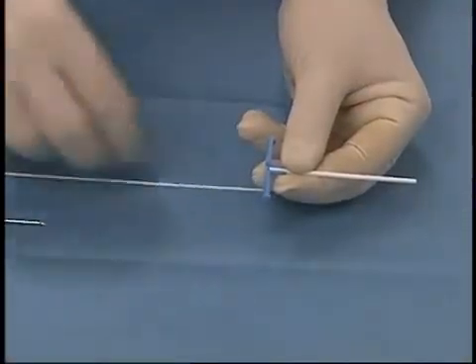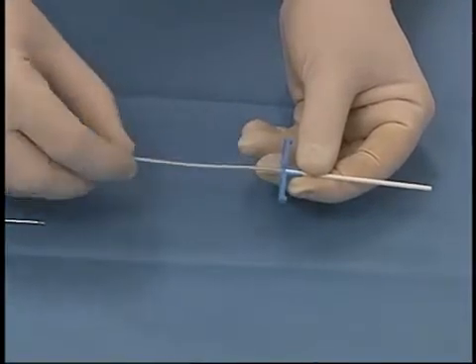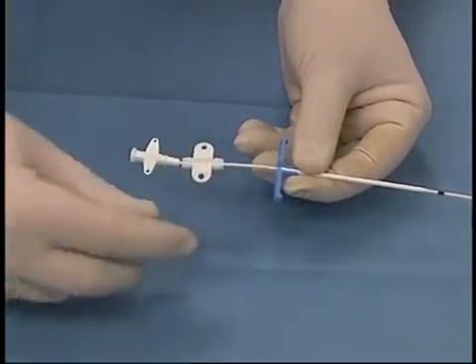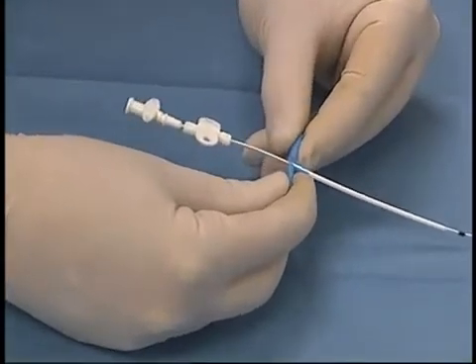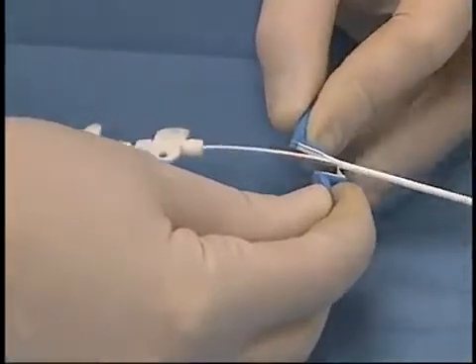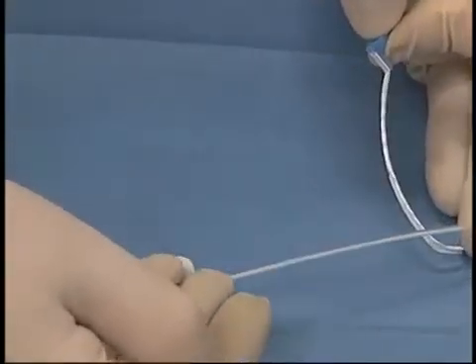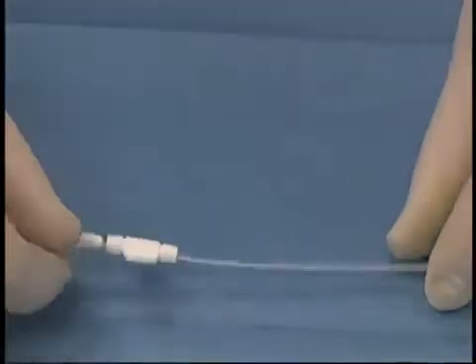A peel-away sheath with a stylet is inserted into the vessel. The stylet is removed and the catheter is inserted through the peel-away sheath. The catheter will be inserted to a pre-measured level. Once it has reached that level, the peel-away sheath is snapped and gently peeled off the catheter. At the same time, the catheter is inserted more completely into the vessel. Once the catheter is completely in the vessel, it will be sutured in place.